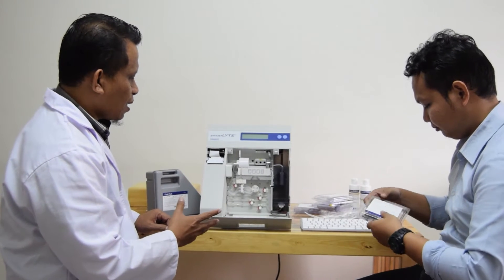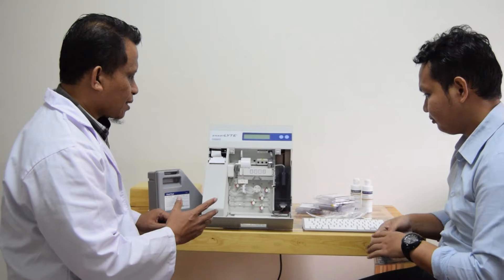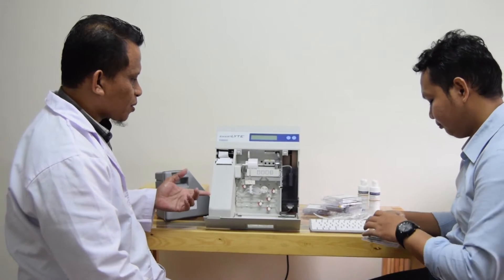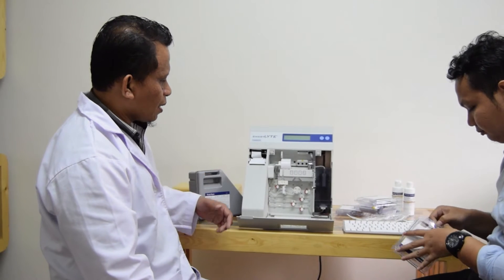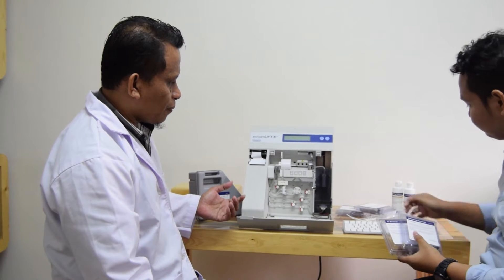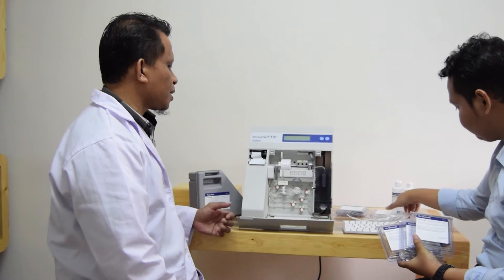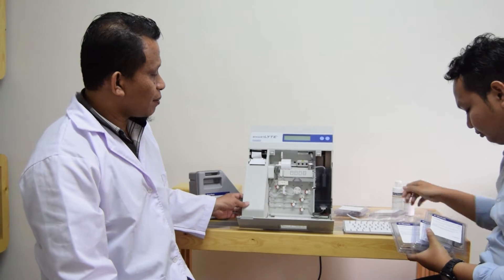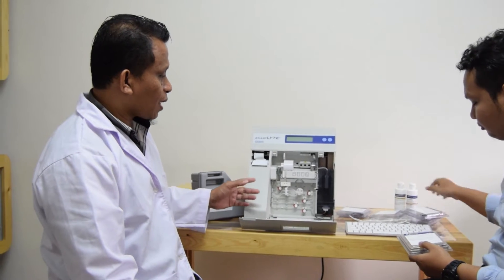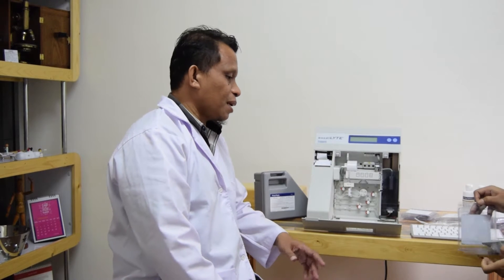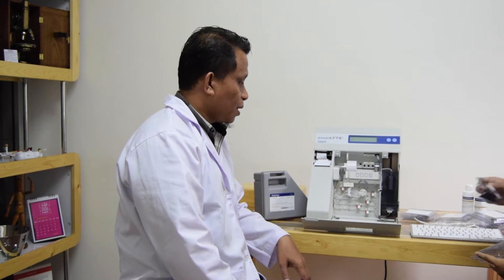Sekarang, Mas Fais, tolong bantu saya untuk membuka box-box elektroda yang ada di situ. Kita akan coba memulai dengan menginstalasi semua elektroda yang ada pada alat ini. Jadi, di situ ada beberapa box. Ada Na, Natrium, Kalium, Ref. Ref ada dua macam. Ada dua bagian. Ada housing dan elektrodanya.